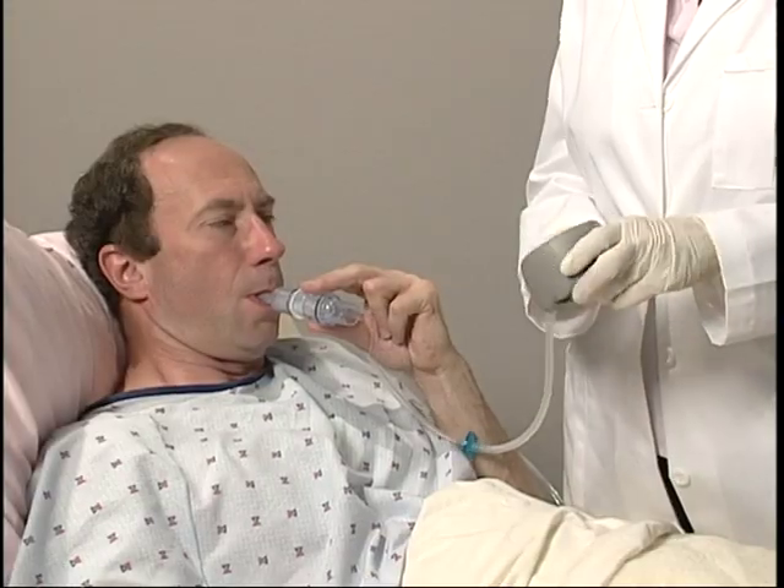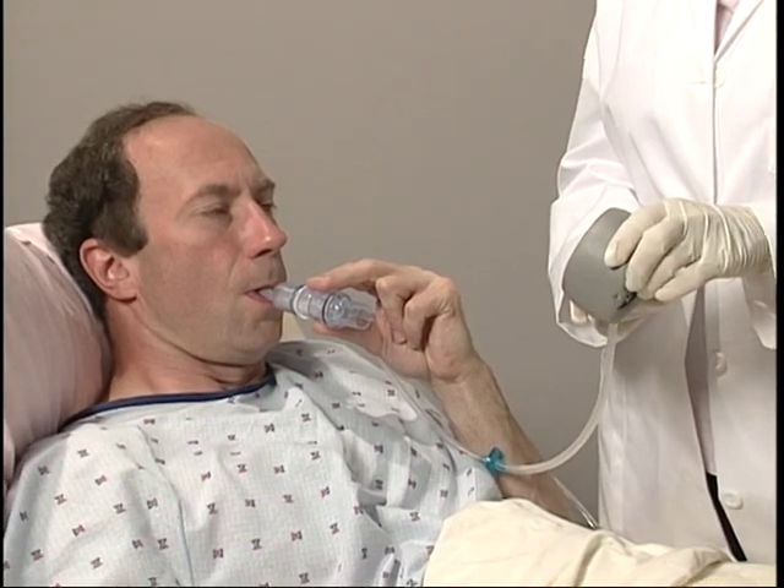Atelectasis is the collapse of part or all of a lung due to the blockage of the air passages or very shallow breathing. Most often, a patient is vulnerable to atelectasis postoperatively. It's important to expand the lungs during recovery to prevent or reverse the effects of atelectasis, which may foster pneumonia. Positive airway pressure, or PAP therapy, enables splinting open the airways to help stabilize them and reinflate collapsed alveoli.